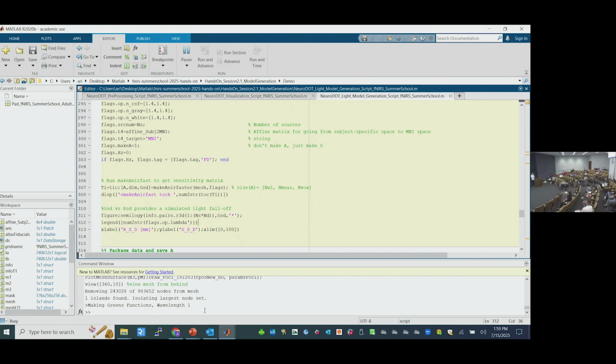So how do you determine the baseline optical properties for each of the layers? Yeah, that is a great question. How do we determine the baseline optical properties? That is usually from previously established papers from the literature. You could probably run tests to measure those yourself, but I personally don't know how to do that, so I'm not going to advise that.